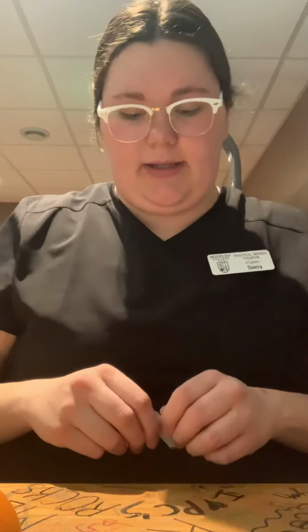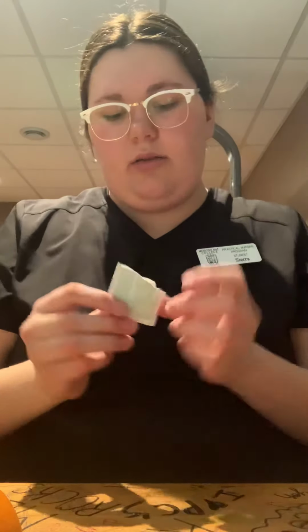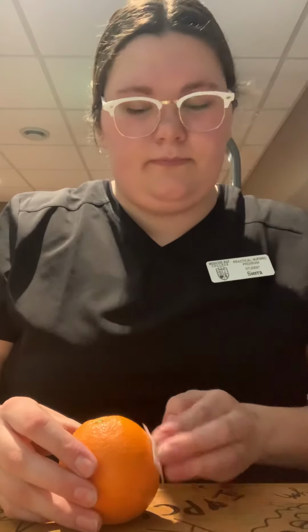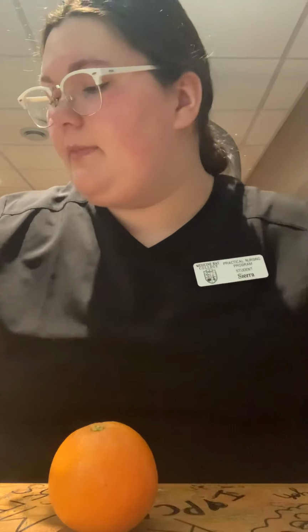So set this down, move our amp out of the way so we are not spilling any, and we're going to get our alcohol pad and we are going to clean our patient again. Letting that air dry.